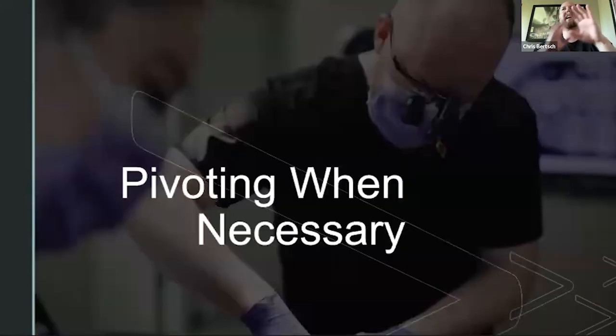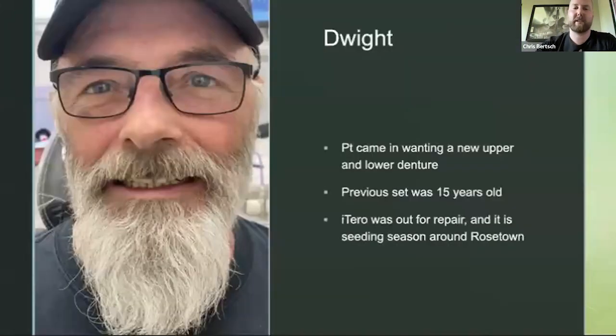Okay, so this is the end of the reline part, and then we're just going to switch gears and talk about pivoting when necessary. Like I said, our iTero was down recently, so I had to go back. In this case, I wasn't able to capture that area in front of the incisive papilla, so it was so frustrating. So we had to do the technique that I did before digital dentures, which is like a 3D matrix. The point of this is I just want to show you a different way to do it.